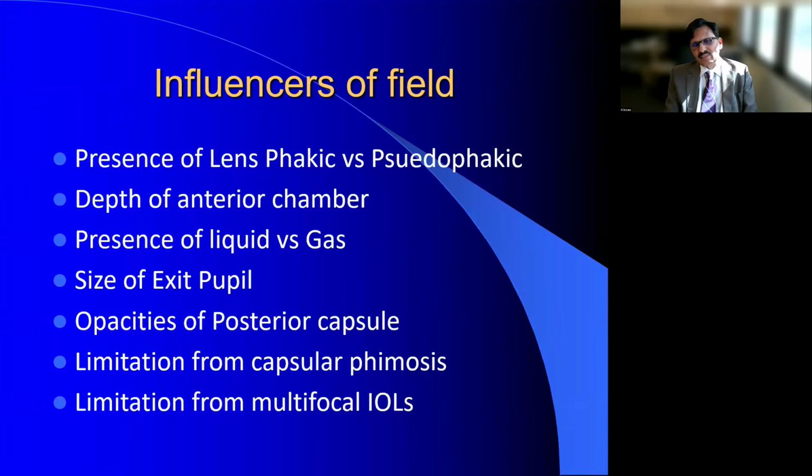Then the second physics principle that you need to understand is the gas bubble. Often we do an air-fluid exchange halfway through, and after that you do whatever you need to do. Gas exchange increases your field of view for two reasons. One, gas pushes your nodal point anteriorly towards your surgeon. And number two, there is a change in the refractive index from solution, which is 1.33, to the gas. That also increases your visual field. It's like putting on a high-index contact lens, so that gives an advantage.